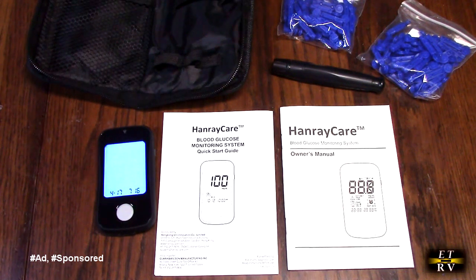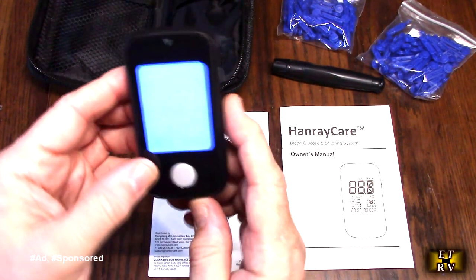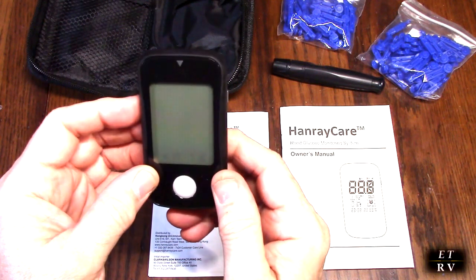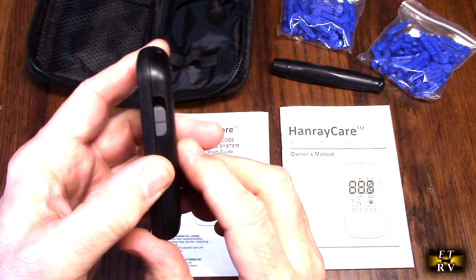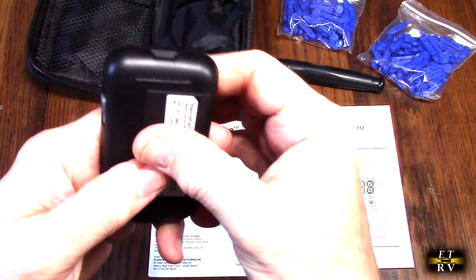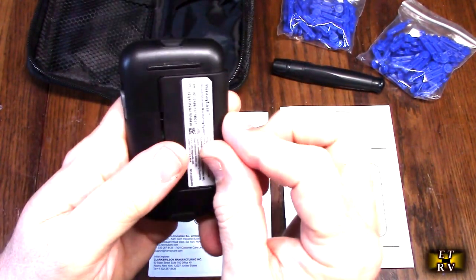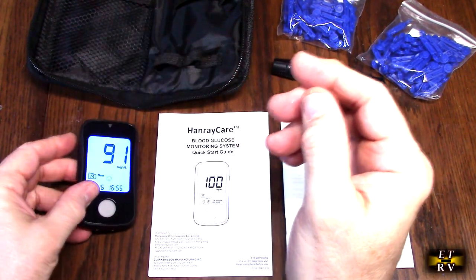Their blood glucose monitoring system kit. It comes with the monitor itself, which has a really nice, very bright lit display. It's got the date, you can set the time. You can see it's blinking as it wants me to add a test strip. It has a test strip ejector and an on/off button, and it comes with the batteries included, which is nice and simple to use.